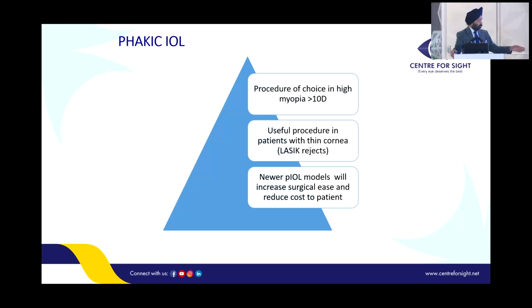As Partha was saying, when we started the laser, I have treated up to -18 with my Summit laser. It was a broad beam laser. You must have also treated higher. My mother-in-law is -13.5. Great. So the -18 patient is still doing well.